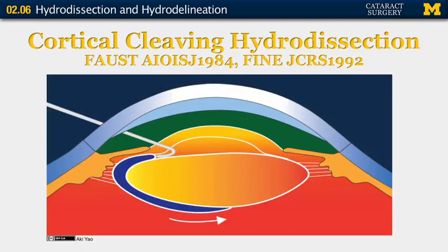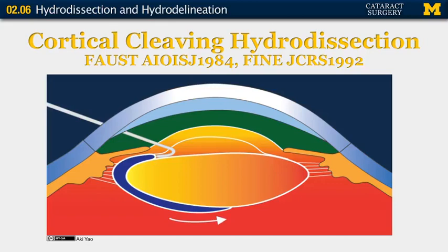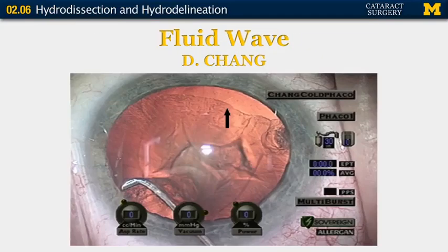This is an example of a J cannula being used to force fluid behind the lens. You can see that the capsule bulges away from the lens tissue. This example shows the process at several sites, usually starting distal from the incision and then moving towards the incision in the subincisional lens. You can see the edge of the fluid wave behind the nucleus moving away from the side of the injection.